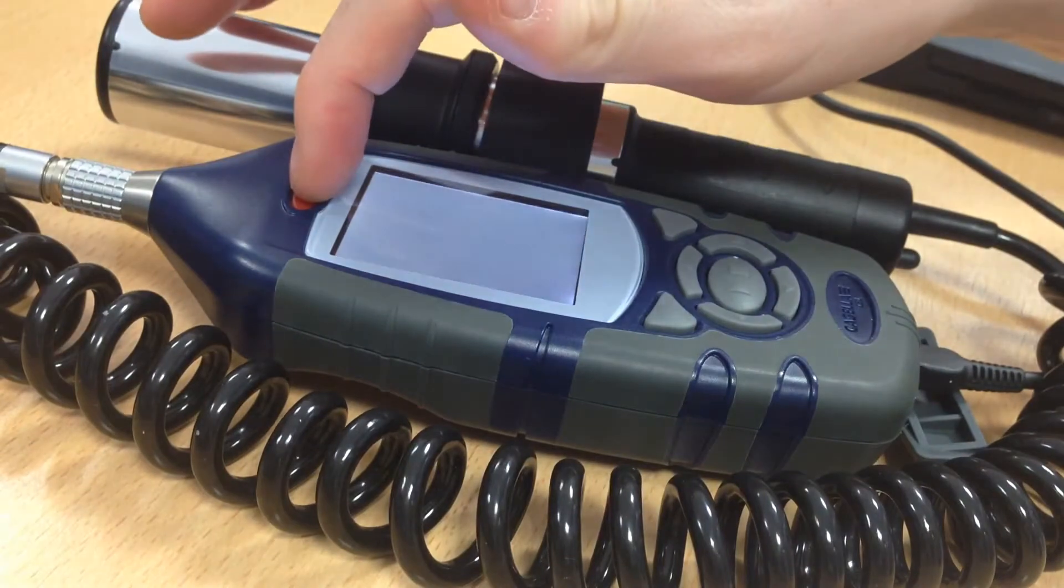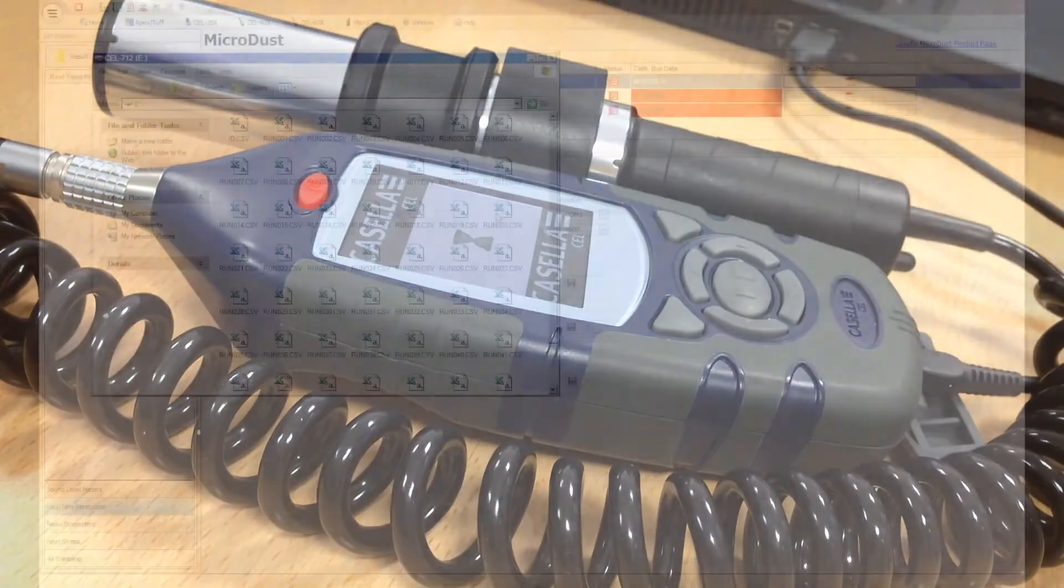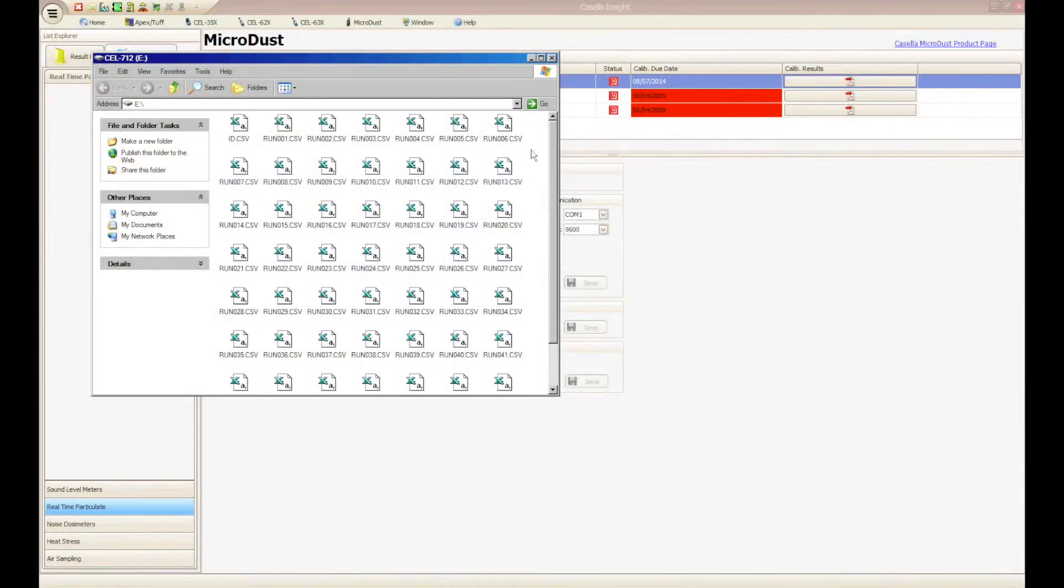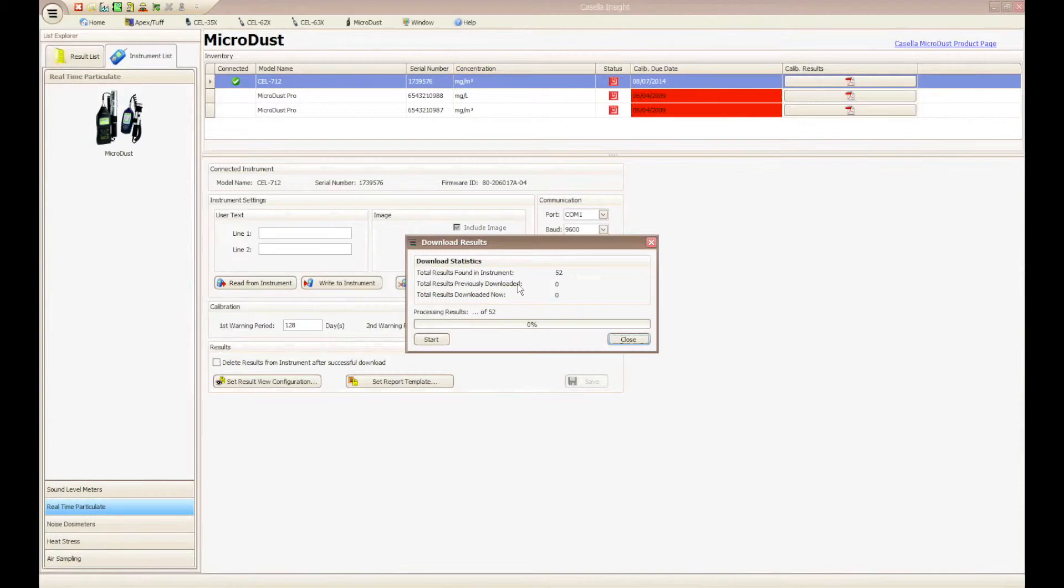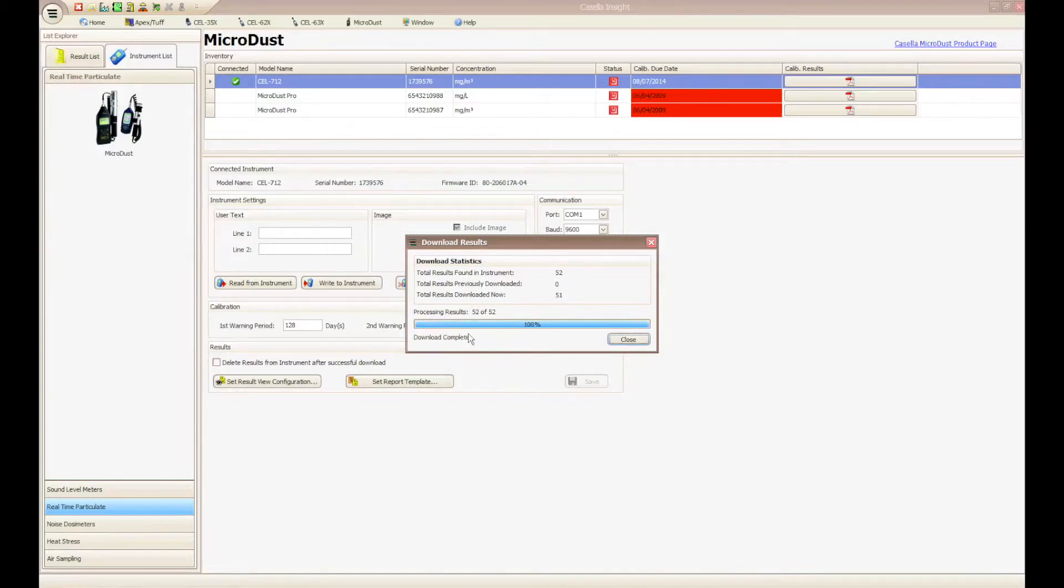A Windows Explorer box will appear showing the results on the instrument in CSV format. Close this Windows Explorer box and after a few seconds a download dialog box will appear in Casella Insight. Click Start to initiate the download process.